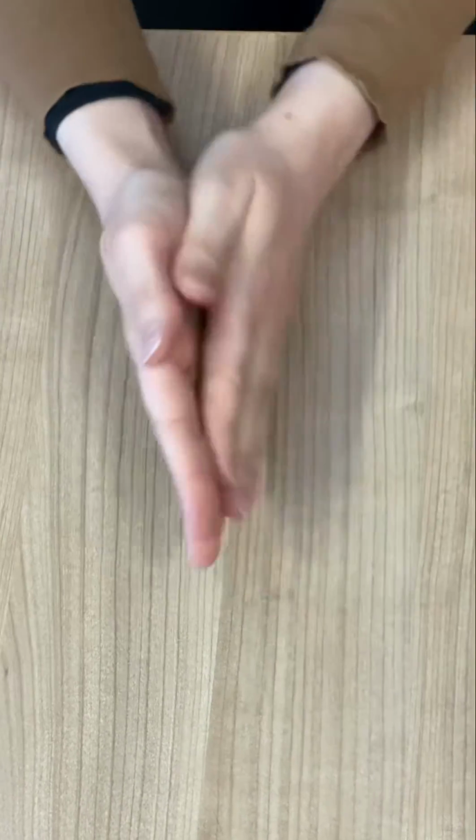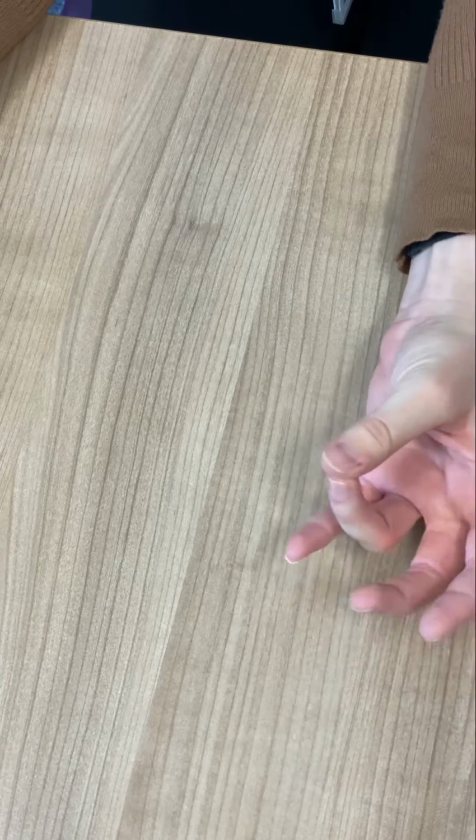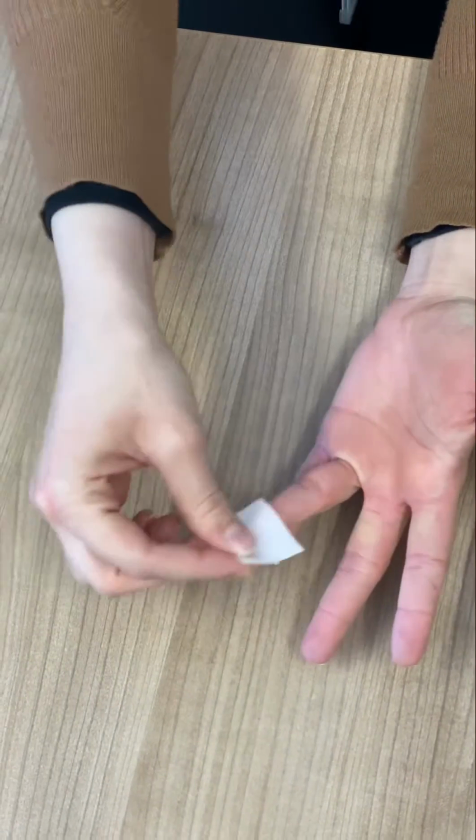Warm up your hands to help with your blood flow, and then take a sterilising wipe and use it to sterilise your finger of choice.